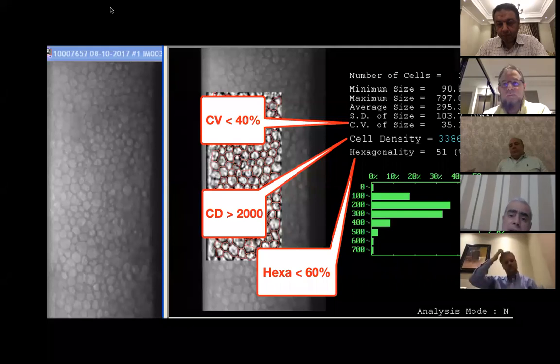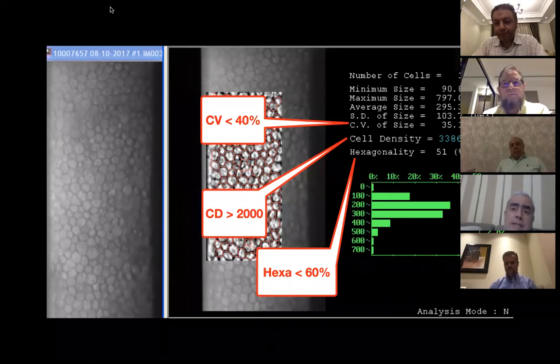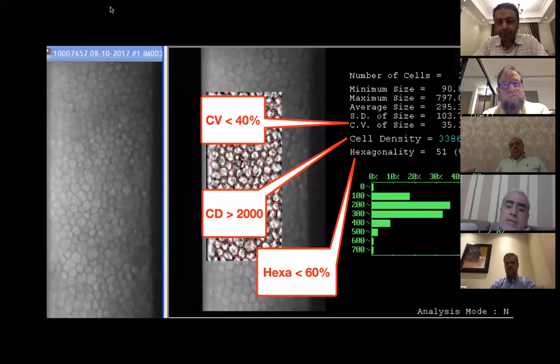You have a high density, or relatively good density, but the coefficient and the hexagonality are not very good. So one should be careful when looking at the measurements of the endothelium. And it is very good that you have raised this issue. If you are an excellent phacosurgeon, when you enter the anterior chamber, you will lose 500 cells density. And then the coefficient, which is borderline, or the hexagonality borderline, will drop to 50%.